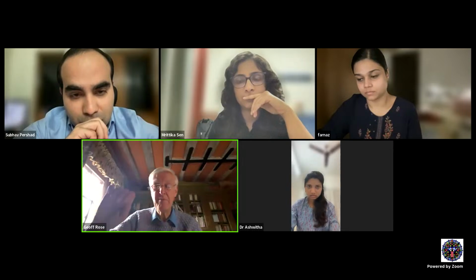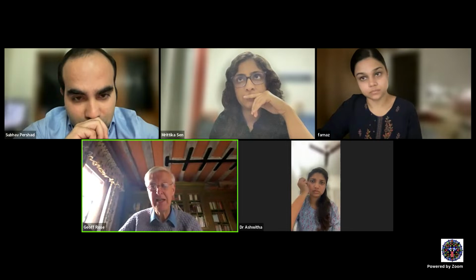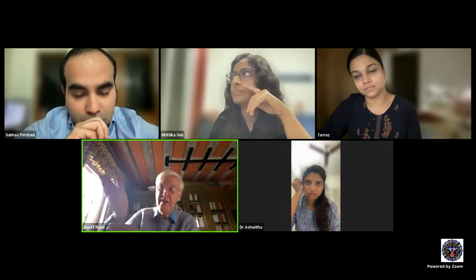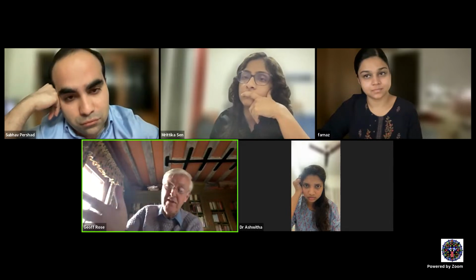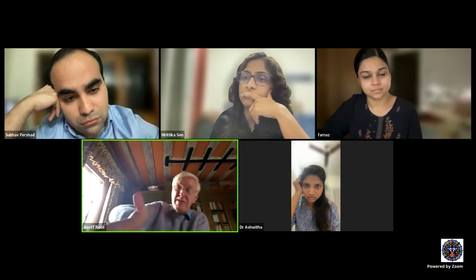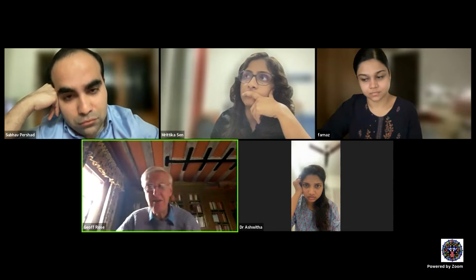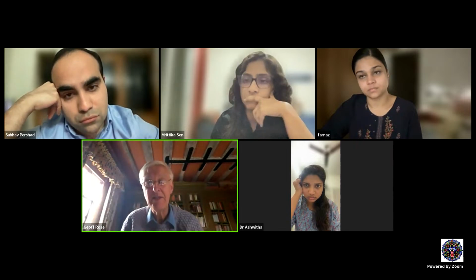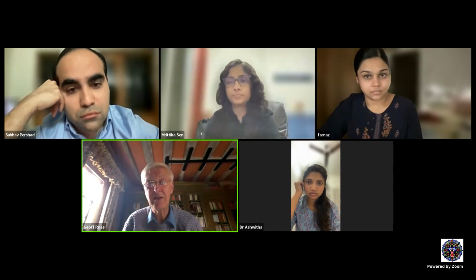The reason being that the lower lid swinging flap, when I close it, I only put one conjunctival suture at the lateral end, to bring the conjunctiva up to the lower border. The medial end, of course, is fixed. And so there actually is a gap between the conjunctiva and the lower lid, so fluid can escape that way. So in general, I will not put drains unless you're in the posterior third of the orbit.